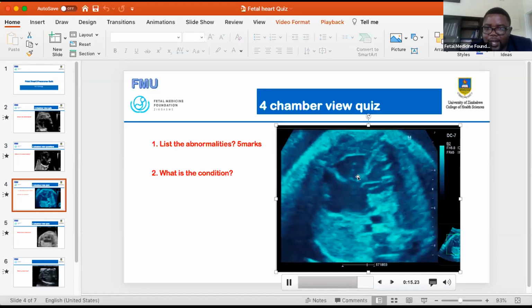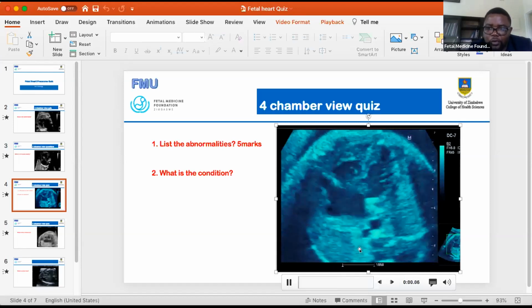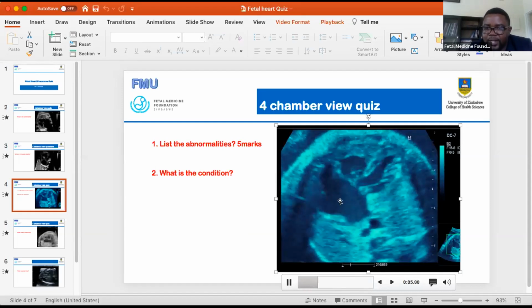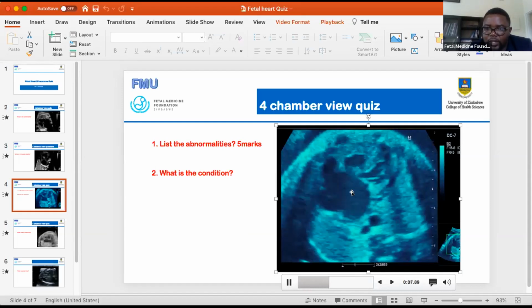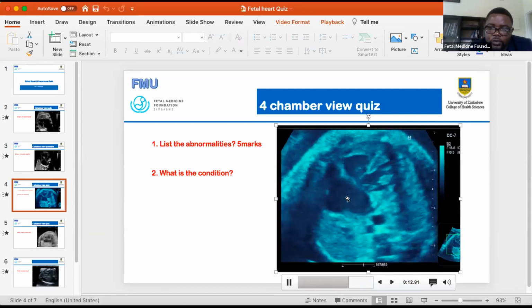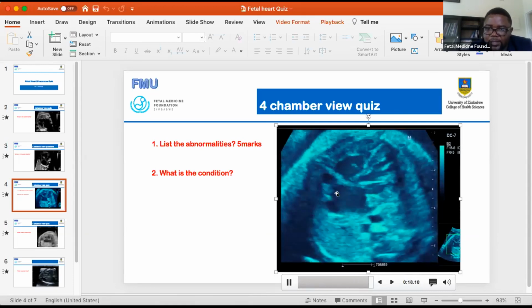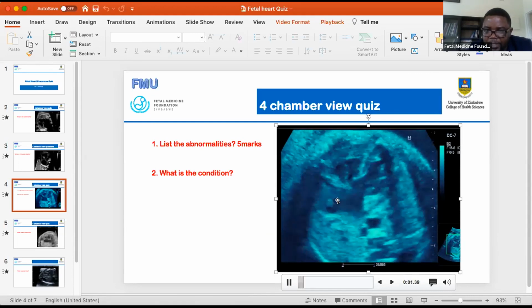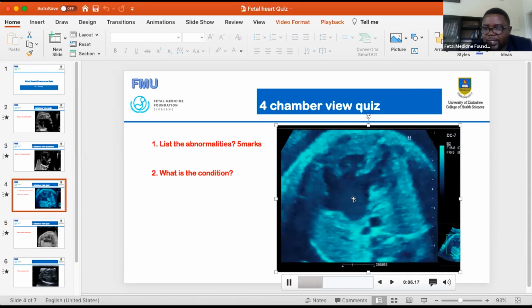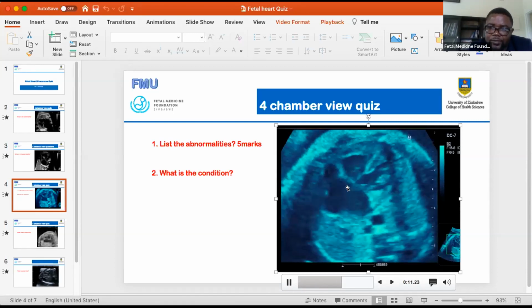You can also see that the heart is deviated more toward the left. The angle of the heart is not normal. And the beating as well. The reason why they beat like this is because they will be missing the sinoatrial node. Remember, the sinoatrial node is in the right atrium. So if we have duplication of the left atria, the sinoatrial node is missing. So they beat closer to the ventricular rate, which is a very low rate. Normally it's under 100. Sometimes they'll be around 100. Sometimes they can go as low as 60 or 50.